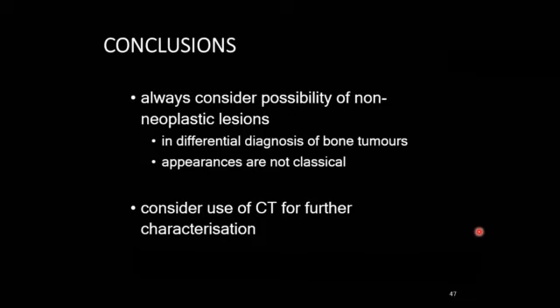X-ray, the plain films, I mean, it is of paramount importance in diagnosing any bony lesion.